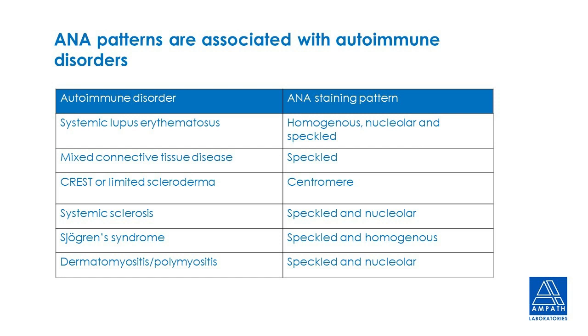The ANA test is considered very useful in the diagnosis of SLE, systemic sclerosis, and Sjogren's syndrome when signs and symptoms attributable to the disease are present. For example, in SLE, if there is evidence of photosensitivity, rash, ulcers, pleurisy, etc. In systemic sclerosis, the presence of Raynaud's phenomenon or skin changes, and in Sjogren's syndrome, dry eyes and mouth. The ANA test is only moderately useful in patients with autoimmune myositis.